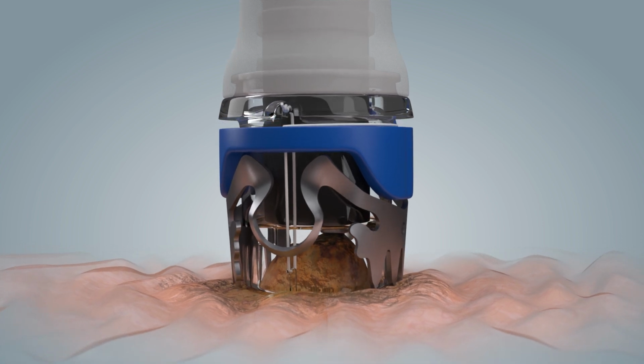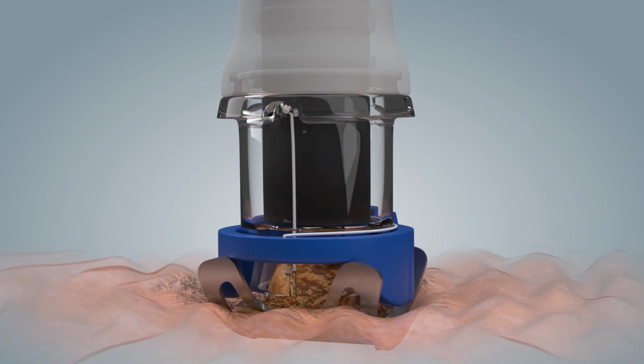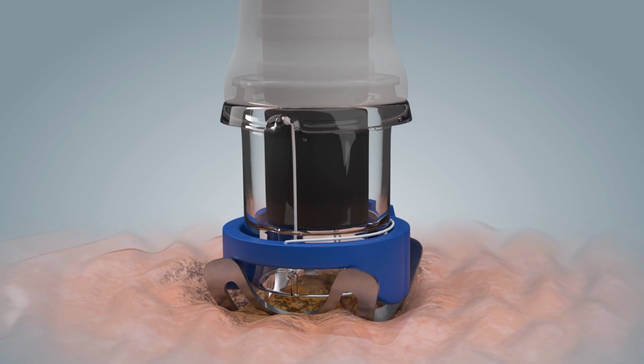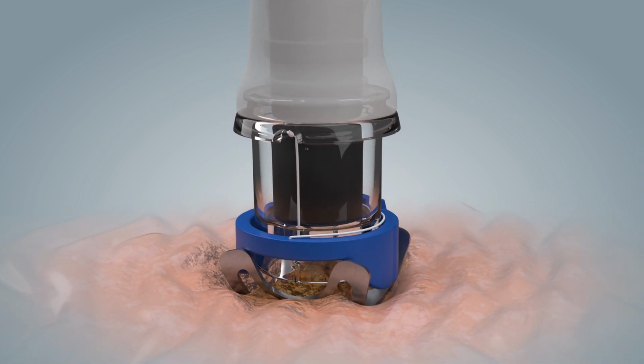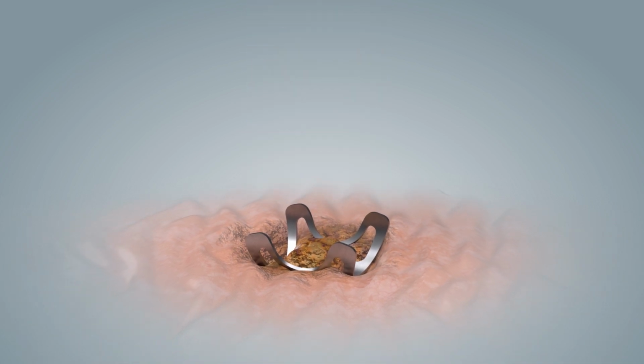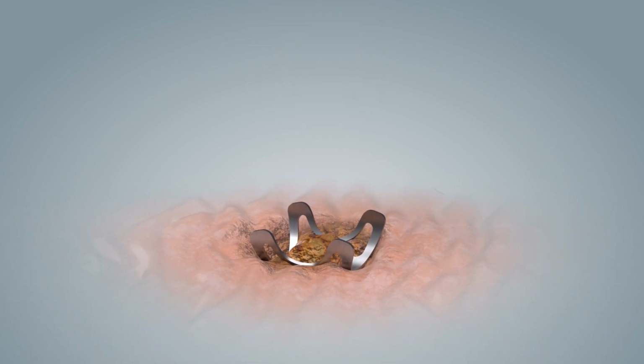Then the clip is deployed, and the OTSC anchor is released from the tissue. After successful clip application, the anchor needles are retracted and detached from the tissue. Afterward, the anchor can be removed from the working channel and the application site can be inspected.